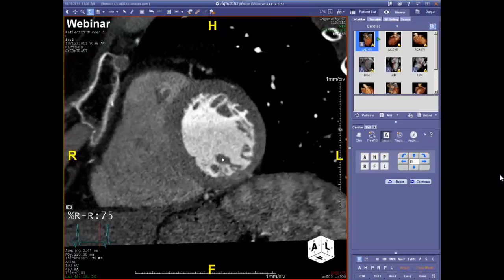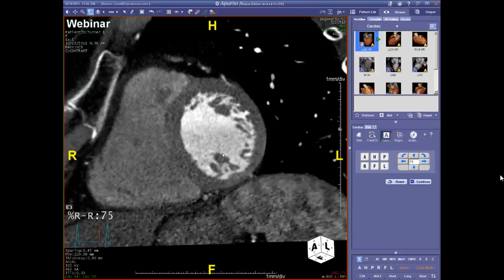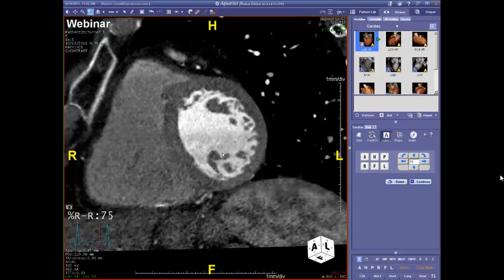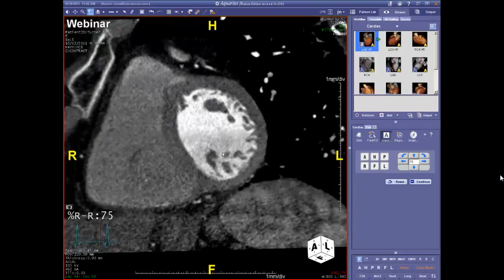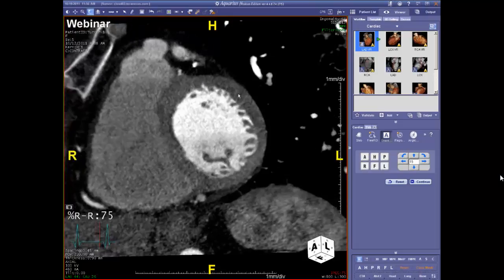As we change our depth in here, we'll move into the papillary muscles and approach the mitral valve itself. We don't have hypertrophy; we do have symmetry of the opposing walls. So a lot of the criteria for normality of the myocardium are met until we look at these big deep hypertrophic crypts over here. So if this is non-compaction, the answer is a definite maybe.